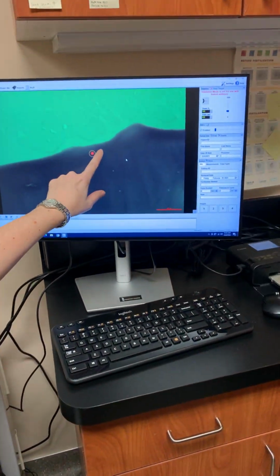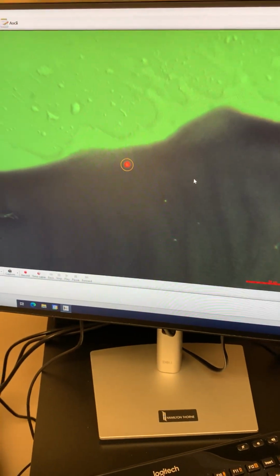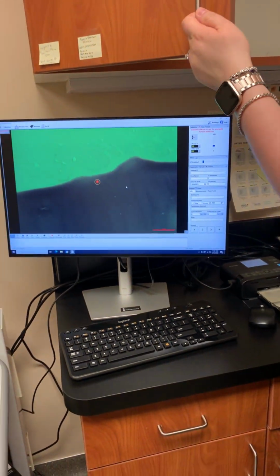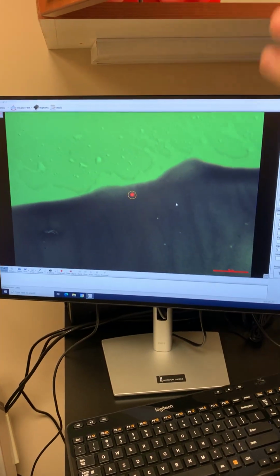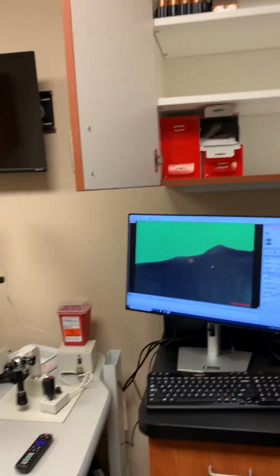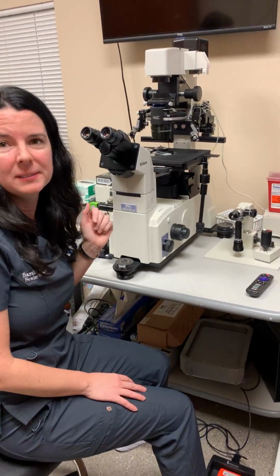Now I've got to bring it up. See that red dot pop up? So that's where I know I'm firing. But no. Okay, it doesn't. The example won't work. Now, what will it do on the screen when you fire? So basically, what I was trying to make it do is show you how it blasts away a circle right there of it, and it is not behaving itself because I can't find the actual example of the box. So I was looking for the box that had it in there.